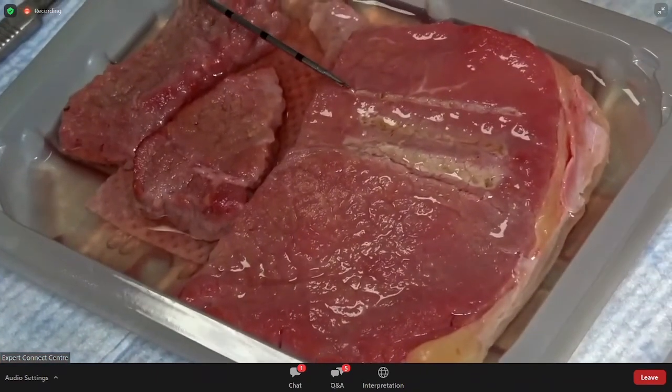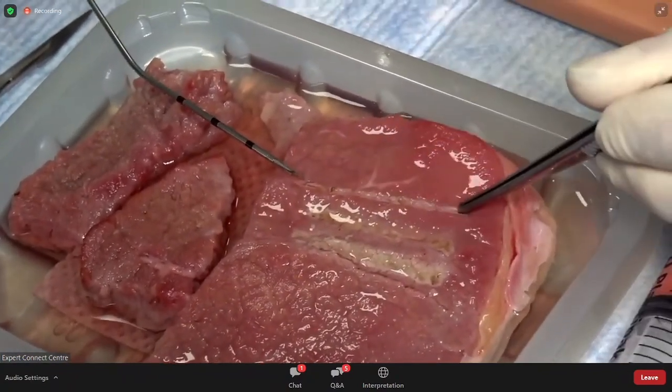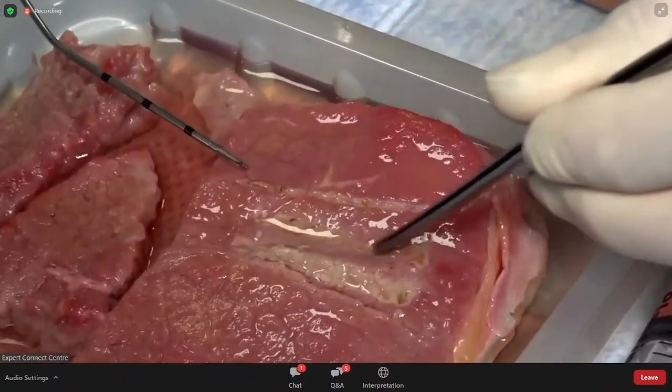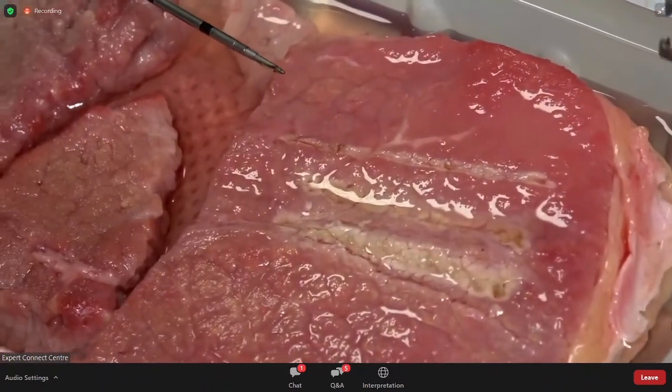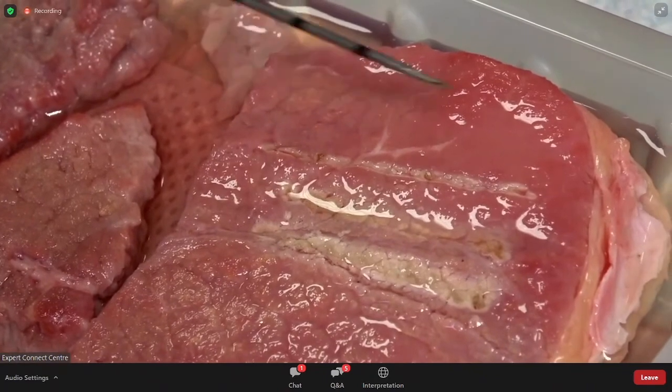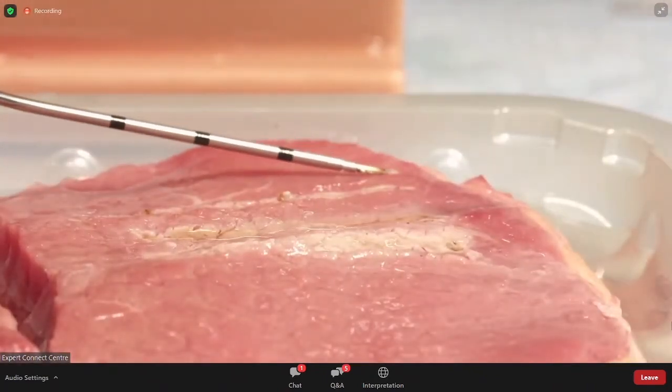And you can see it is slightly narrower in terms of the ablation of soft tissue compared to the turbinator. But that's because the turbinator is a 2.9 millimeter diameter instrument. And this is what it looks like when you coagulate mucosa.